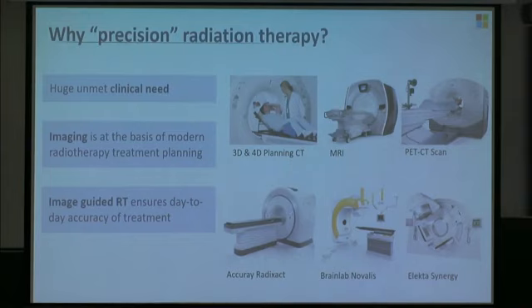Okay. And we're using image-guided radiotherapy because radiation therapy generally isn't delivered all in one go. If it's a curative treatment, it takes 5 to 6 weeks treating the patient each weekday. So we need to ensure that each day we remain on target to treat the tumour target.